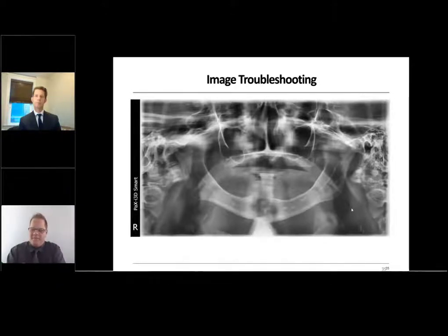So I see some clinicians saying it's kind of like peanut butter stuck to the roof of your mouth, or super glue. Some say, I know, Jim, don't you tell them to swallow, push that tongue up. So I think people say it differently. Right. So as long as you have the tongue flat to the roof of the mouth, that's basically the main thing on how to relate that to our patients there.